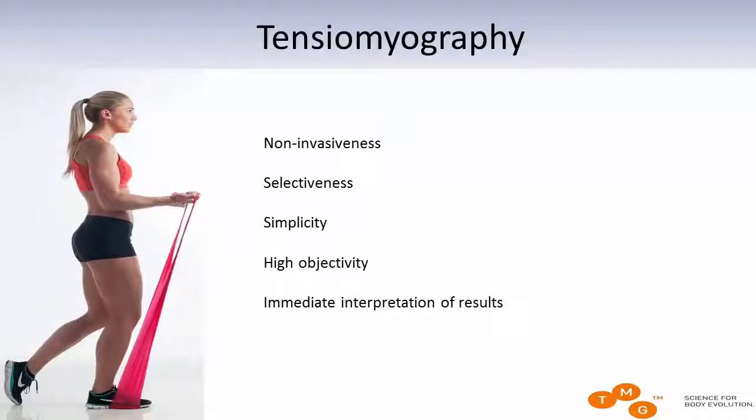You can even measure just before competition to see how the muscle profile looks at the time where the subject is, let's say, at their peak, because in some sports, when you have 1 or 2 big competitions per season, you plan everything so that you will be the best on that particular day. And if you can record that, that's quite useful information. It is selective, as you probably got the idea, so we can measure individual heads.